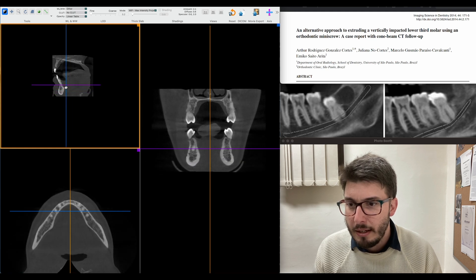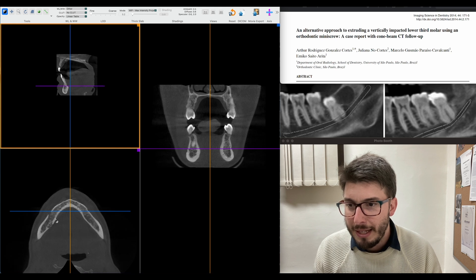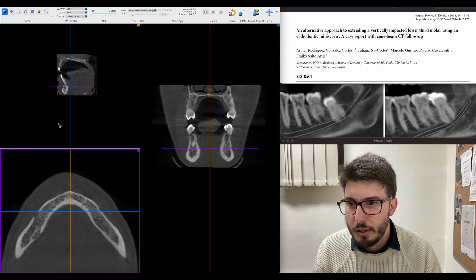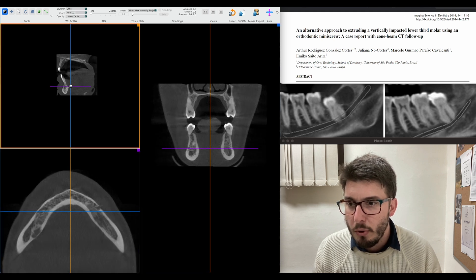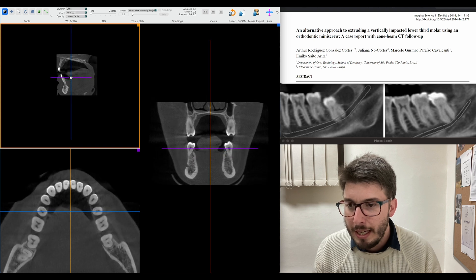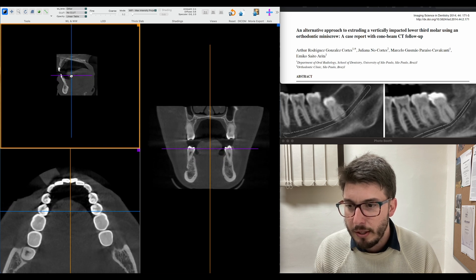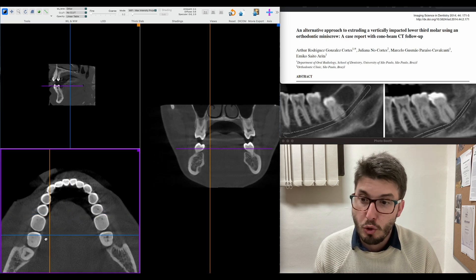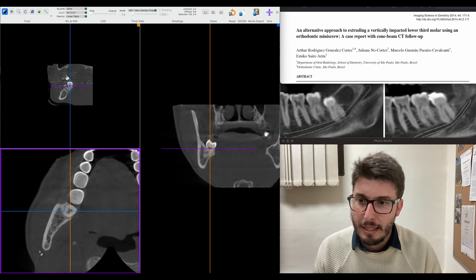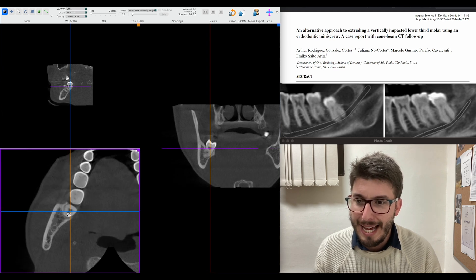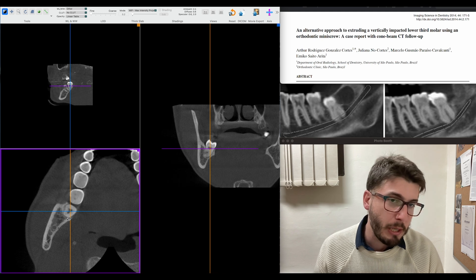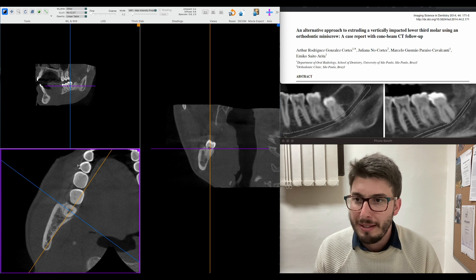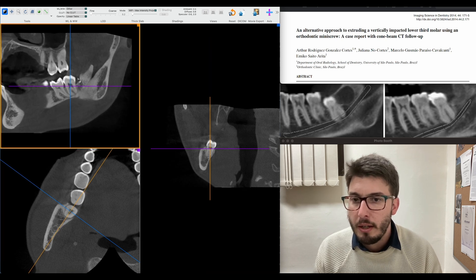Navigating through the mandible, I can see the level of the mental foramen at my cursor position. Going upward I reach the level of the roots and then find the level of the third molar. I drag my axis to the tooth I want to diagnose and make the axis parallel — or perpendicular — to the tooth I want to assess and plan surgery for.